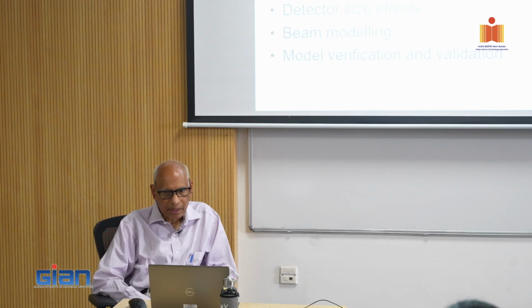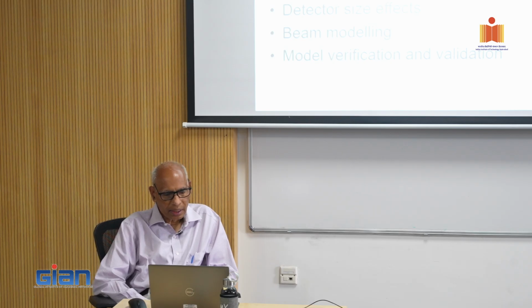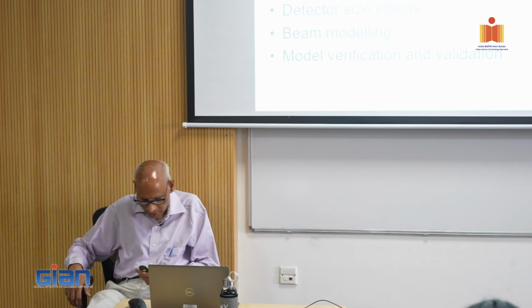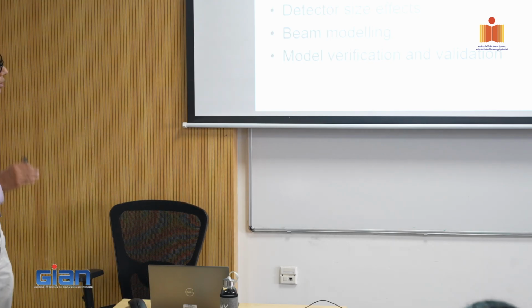Nowadays, everything is computerized. You have a computerized treatment planning system, so you use it. So one of the major tasks of the commissioning process is to model the beam in your computer, okay, and that requires a lot of dosimetry measurement, because eventually what you give to the computer to model your beam determines how accurately you are calculating the dose for the patient treatment fields, okay. So I give it a name: dosimetry under non-reference conditions.